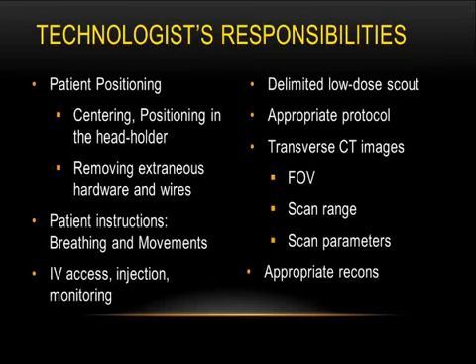So moving on, these are the technologists' responsibilities. They are responsible for patient positioning, centering, removing all the extraneous hardware, patient instruction, stop breathing, IV access, monitoring the IV access, delimiting the scout, making sure that the scout was performed at a low dose, even though it represents a very small portion of the overall dose. Picking out an appropriate protocol, not doing a temporal bone CT when a brain CT or a sinus CT was prescribed. Making sure that the field of view is right, scan range is right, and the parameters are appropriate. And then making sure that all the reconstructions are done appropriately.